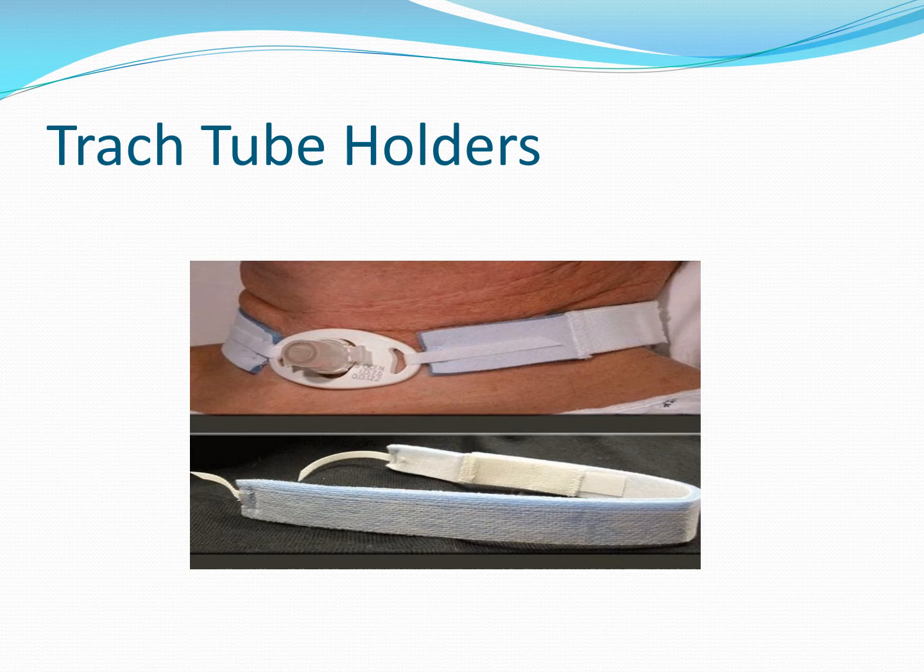So the pressure that it exerts on the skin is pretty concentrated in one narrow band around the neck, and that can promote things like skin breakdown. And when skin breaks down, it can cause further infection, which is not good, but particularly if it's near the trach tube opening, the stoma itself, it's a potential complication that can result in infection around the stoma site and in the neck itself.